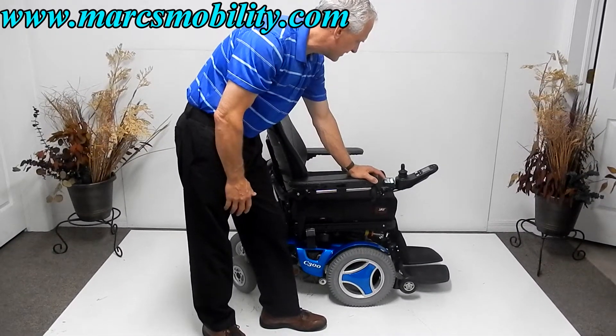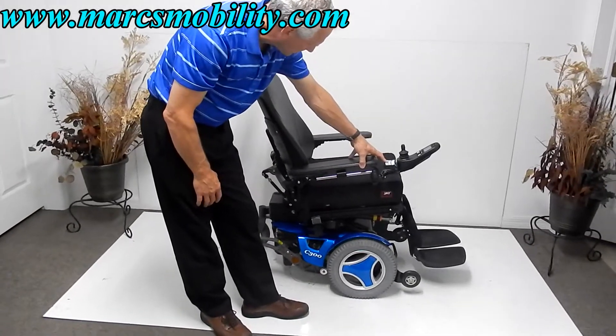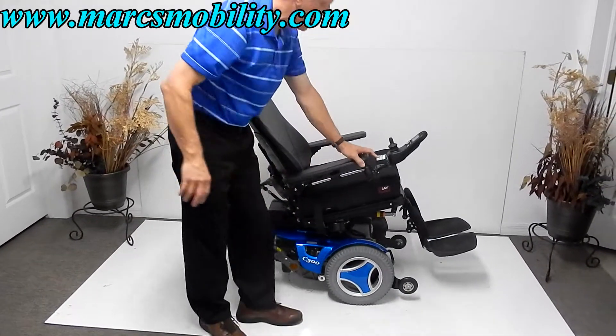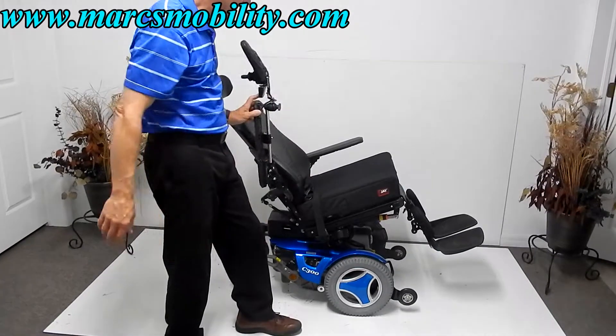The next feature I'm going to show is the electric tilt going back. This chair does have a safety belt, which I'll cover in a few minutes. The arms are adjustable, so if you need to move them out of the way to get in on both sides, you can.